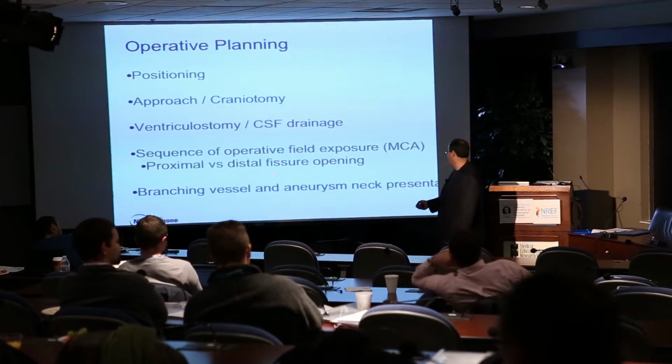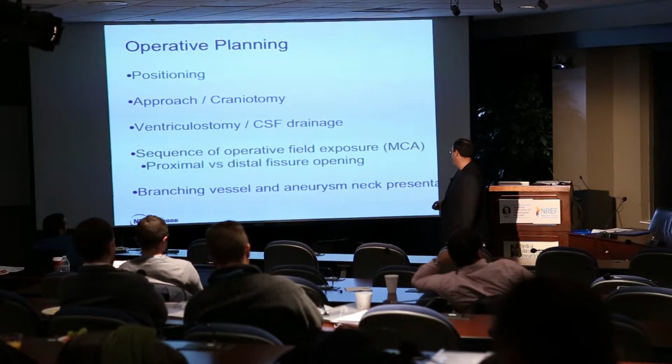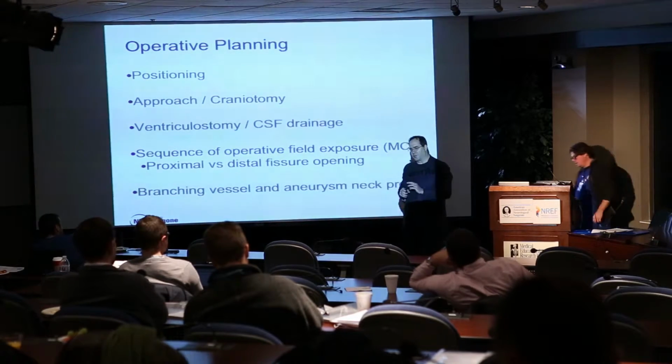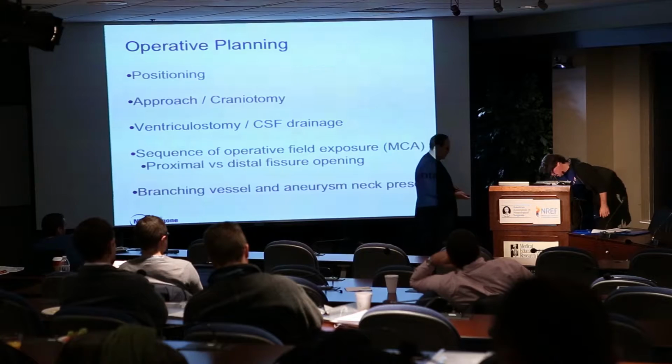And then again, branching vessel and aneurysm neck presentation. You're going to have those all laid out before you place the clips on.